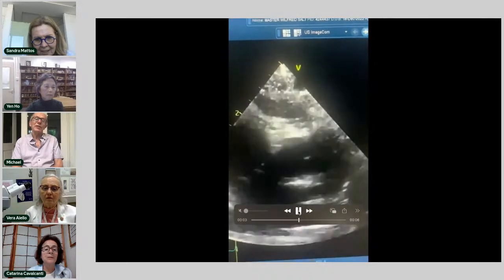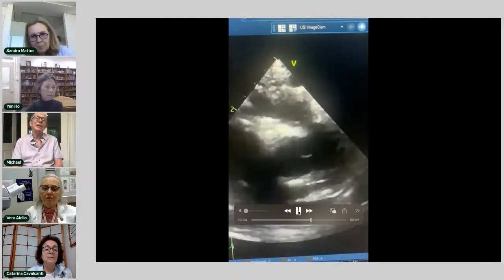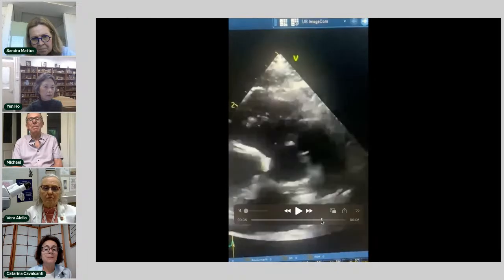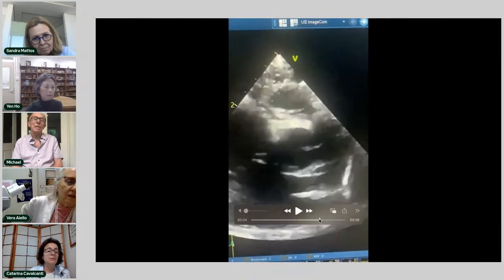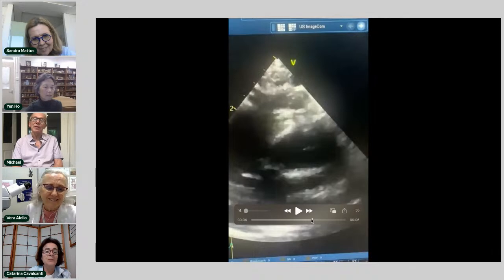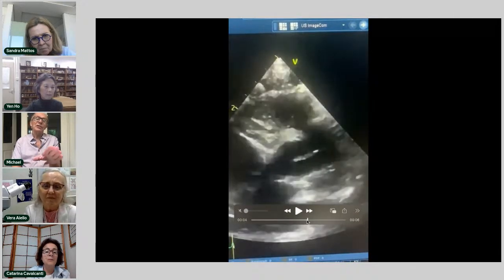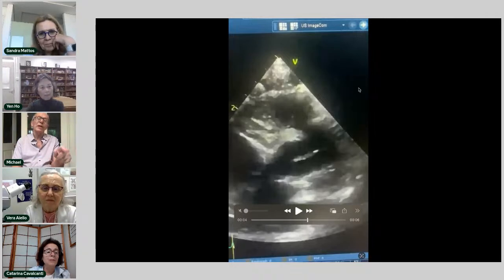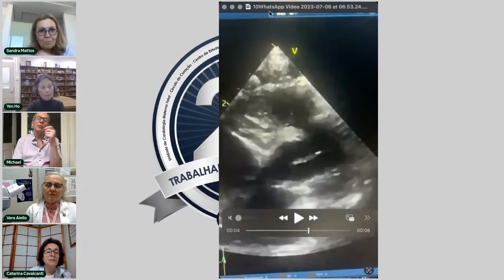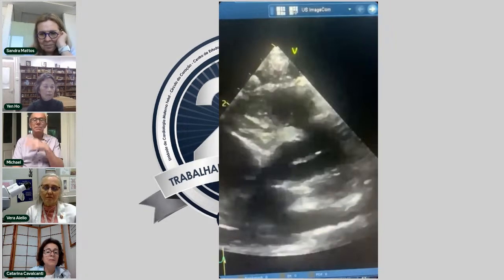Quite a lot of our patients these days, the surgeons ask for a CT to make sure that the patient doesn't have an anomalous LAD from the right coronary. But I find amazing the quantity of information you can get from the echo nowadays. It is, yes. When this was recorded, the person recording the echo didn't realize there was an anomalous LAD and didn't linger on the picture very well. It was only when I was looking through it that even I recognized the LAD. So my vision is still reasonably good, thank God.